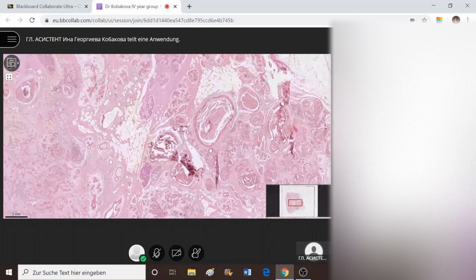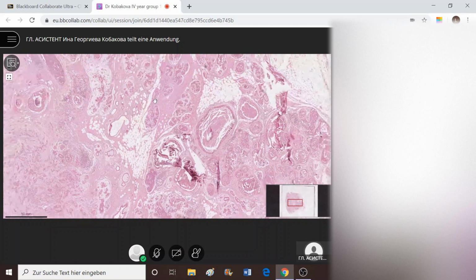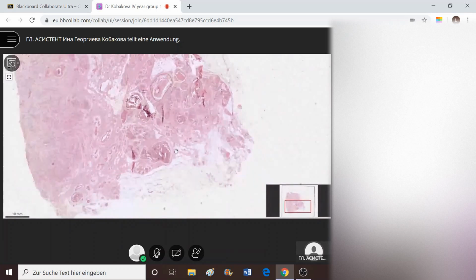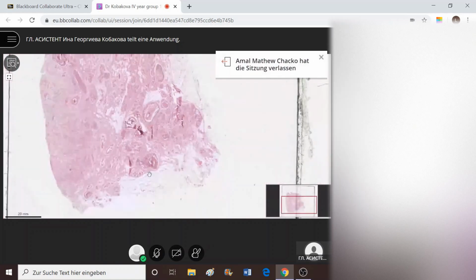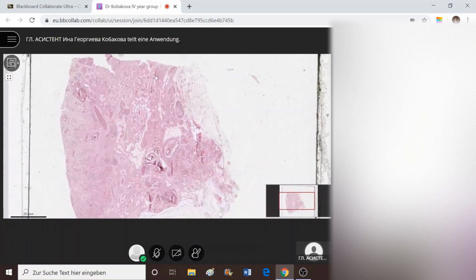So, what we observe here is parenchyma of the mammary gland, which is grossly appearing. They have margins of mature fat tissue here and there, and thick stroma, which becomes a little bit more loose around clusters of cells forming ductal structures here and there with papillary growth here.